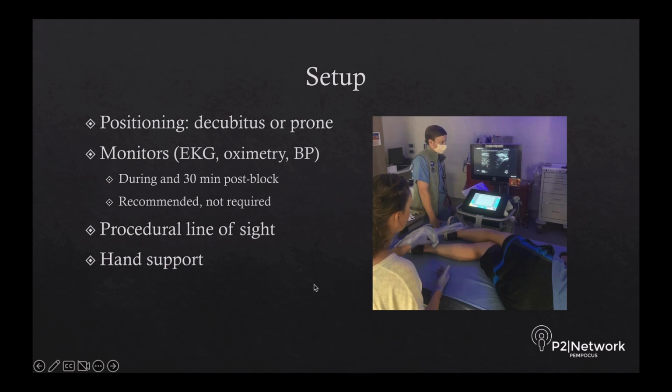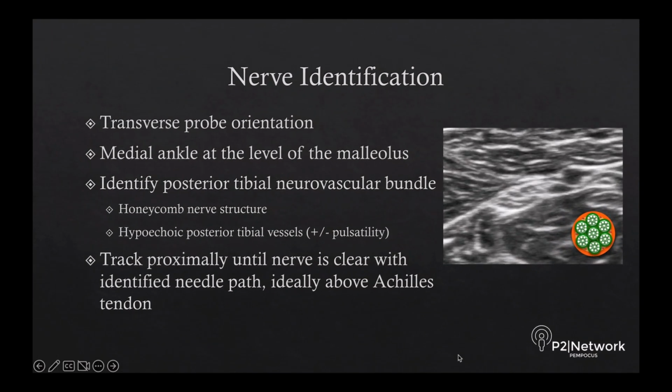Also important is having good hand support. That implies hand support both for the probe hand as well as the hand that's going to be manipulating the needle. Next up, we're going to discuss nerve identification.